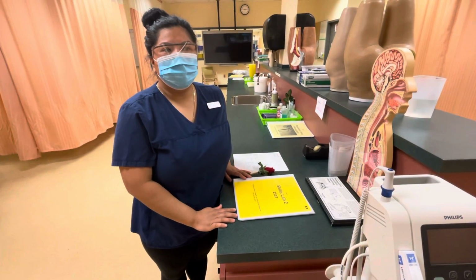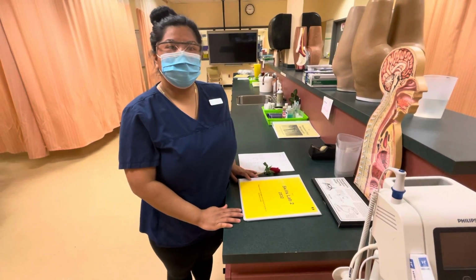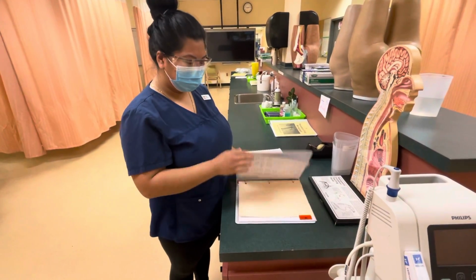Hi, in this video I'm going to demonstrate how to do a wound dressing change using the sterile technique. So the first thing that we want to do is check a physician's order.